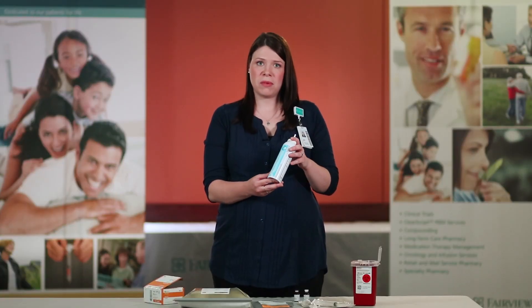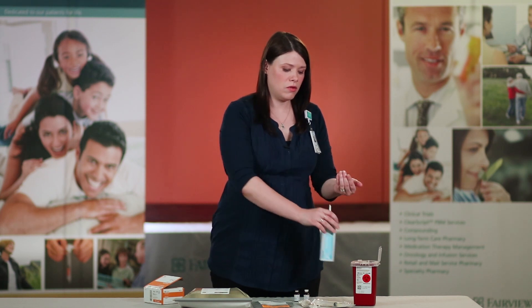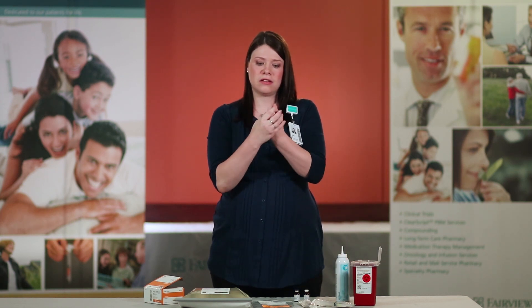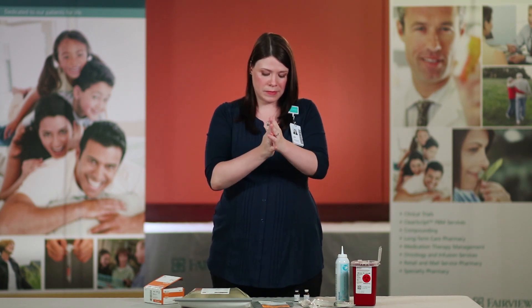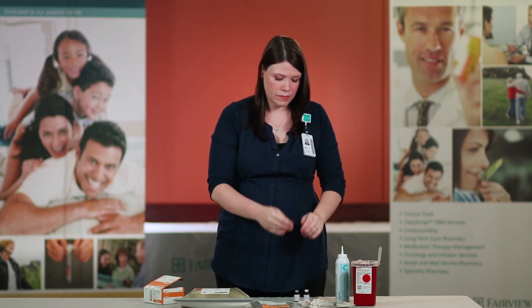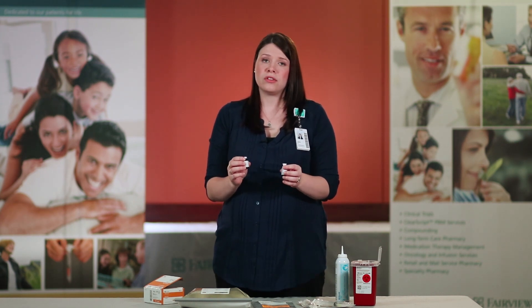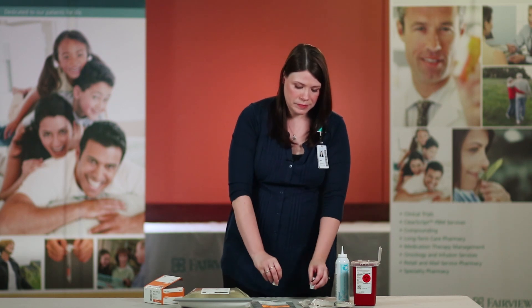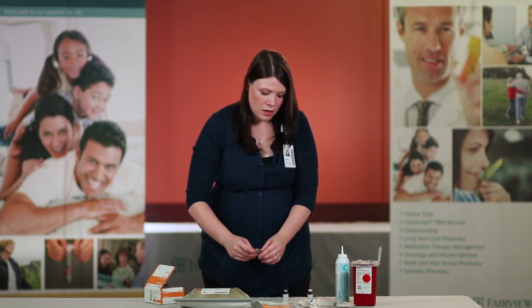If your hands are not visibly soiled, you may use the hand foam sanitizer — remember to apply and rub until dried. It is good to note that if you are administering children's multivitamins to your TPN bag, there will be one larger vial and one smaller vial for this dose. This is an adult dose of a multivitamin.